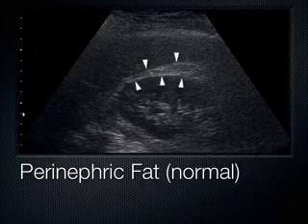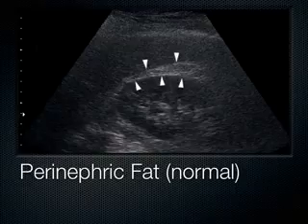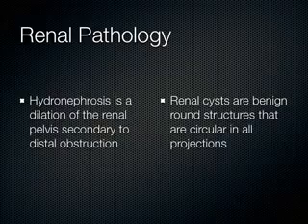One of the things we see around the kidney a lot is fat. So this is just normal perinephric fat. You guys may remember this from last year with your cadavers. Our eye is drawn to things naturally that are bright on the ultrasound screen. So everybody always looks at this and they get kind of excited about it. But really it's just visceral fat around the kidney. There's nothing to get excited about.